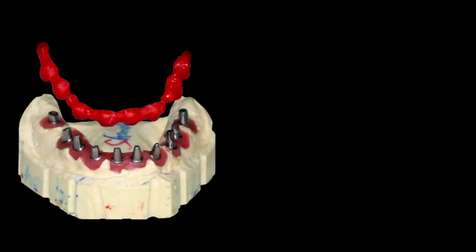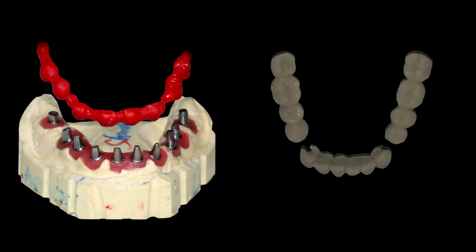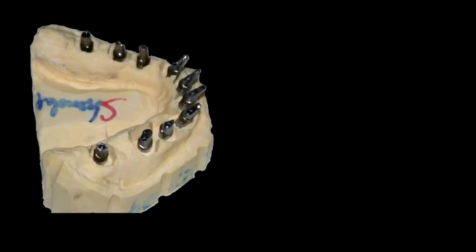How is it done? After making individual abutments, the base of the frame of the future prosthetic structure is modeled on them using ash-free acrylic or composite materials. The temporary structure is also modeled on the abutments. Then abutments are duplicated.